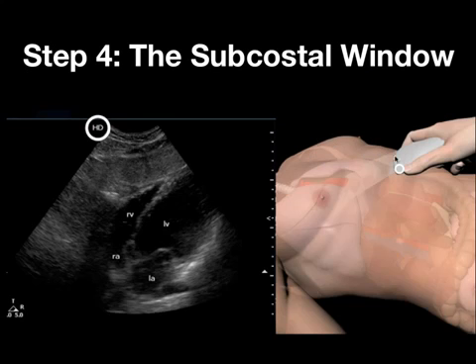As you continue to flatten out the transducer and aim into the chest, now you're going to get your subxiphoid 4-chamber view. So again, here you are anterior and inferior on the abdominal wall. You're aiming posterior and superior into the chest. This is patient's right, this is patient's left. You can see here's the right ventricle, right atrium, left atrium, and left ventricle.